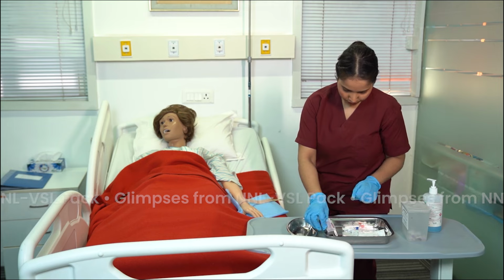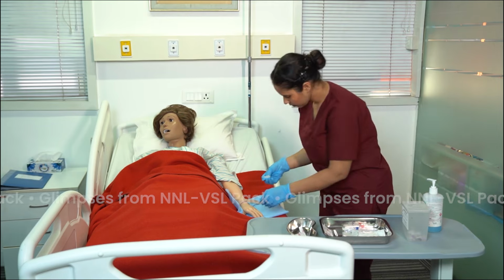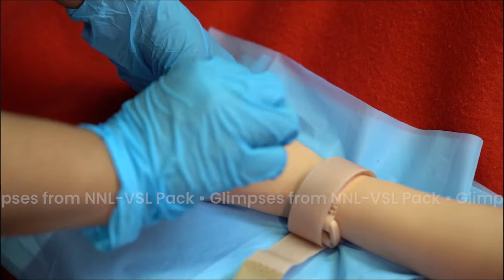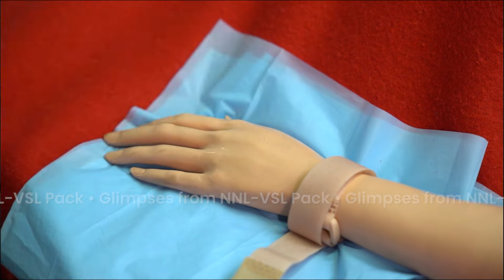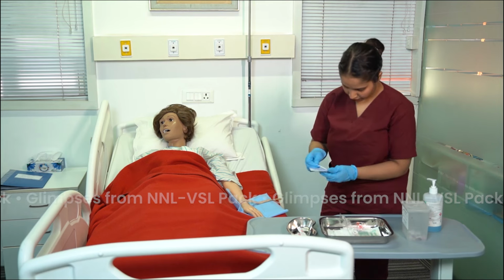Clean the site over the vein with alcohol swab in circular motion from center to periphery and allow to dry. Remove the cannula from the packaging and check all parts are operational.